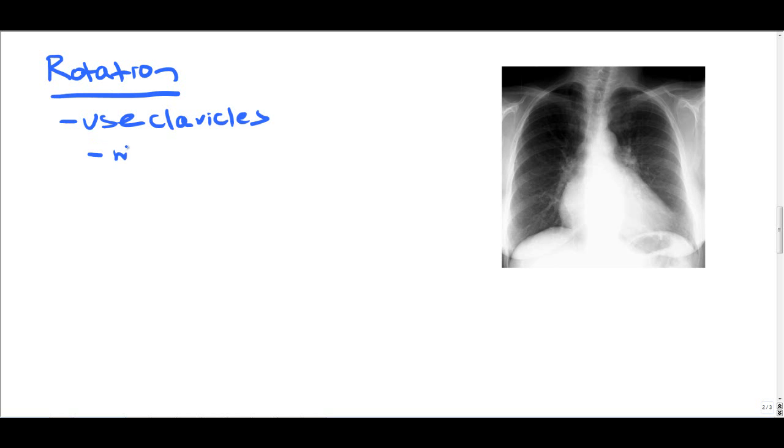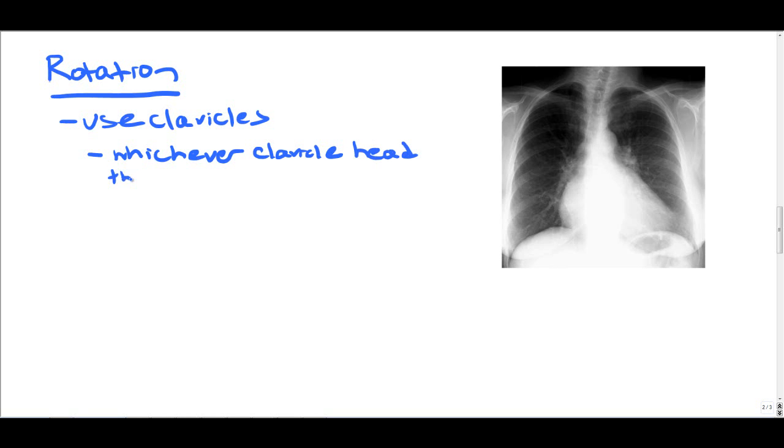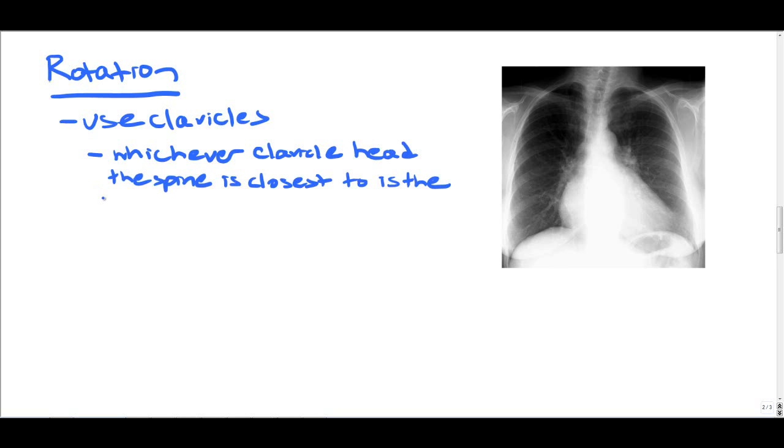You use the clavicle heads as a determinant of whether they're rotating. You identify where the spine is located, and you identify where the medial portions of the clavicle heads are located. Whichever clavicle head the thoracic spine is closest to, that means the patient is rotated to that side. So if the patient's right clavicle head is closest to the spine, then the patient is rotated to the right side.